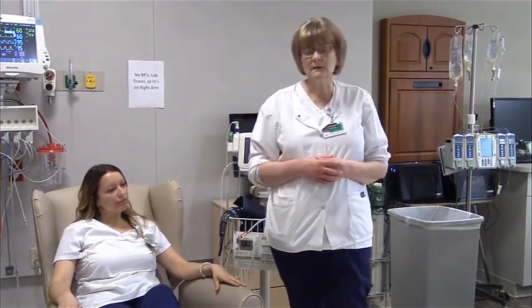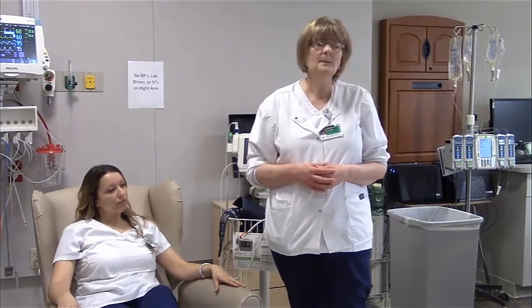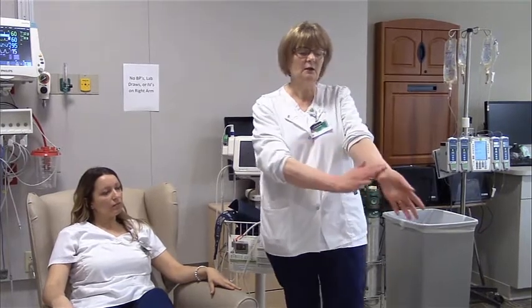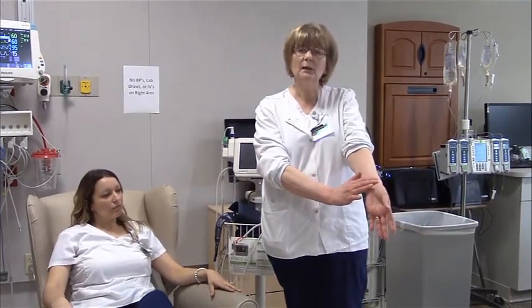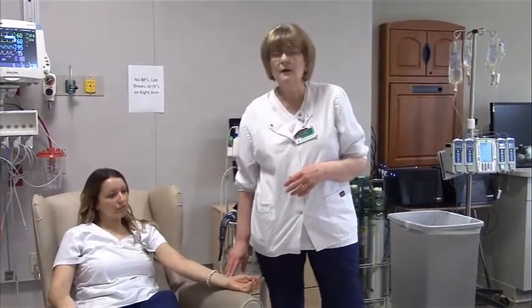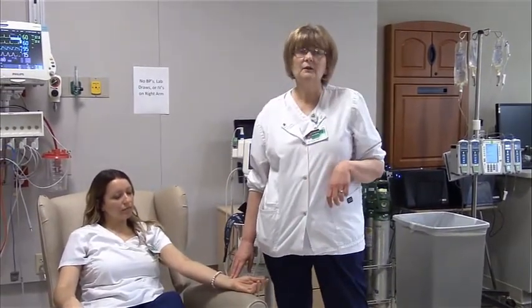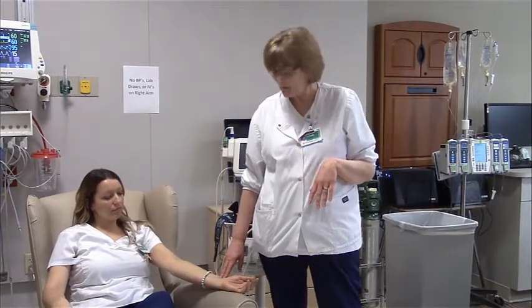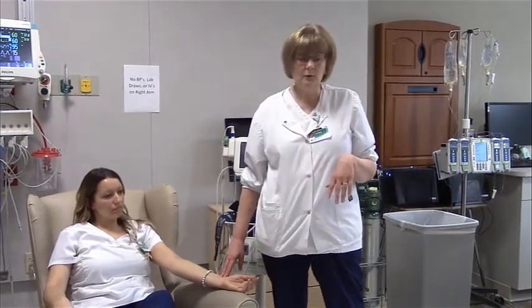The other type of vital sign that we're going to cover is the pulses, so let's go through a few of them. The first one and the easiest one to obtain is the radial pulse. So if you think of your thumb as moving in a radial direction, you want to run that along, and you're going to find the wrist bone, and you're going to apply pressure to the wrist, and you're going to feel the patient's heartbeat. Always use your fingers, because if you use your thumb, you'll just pick up your own heart rate.